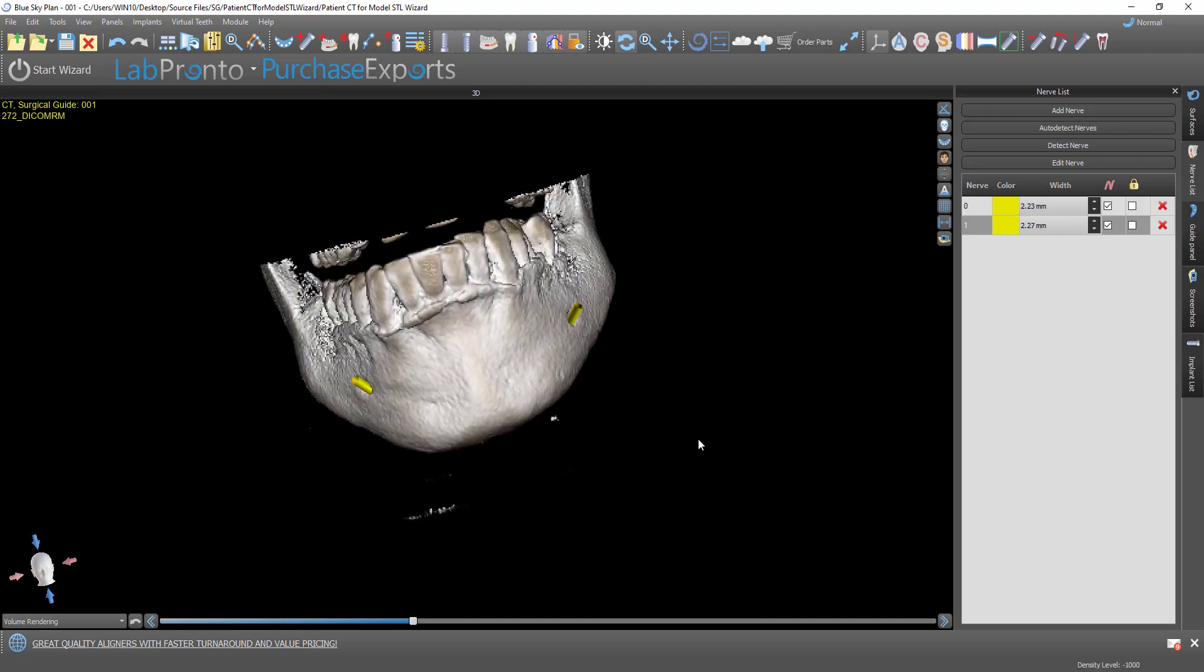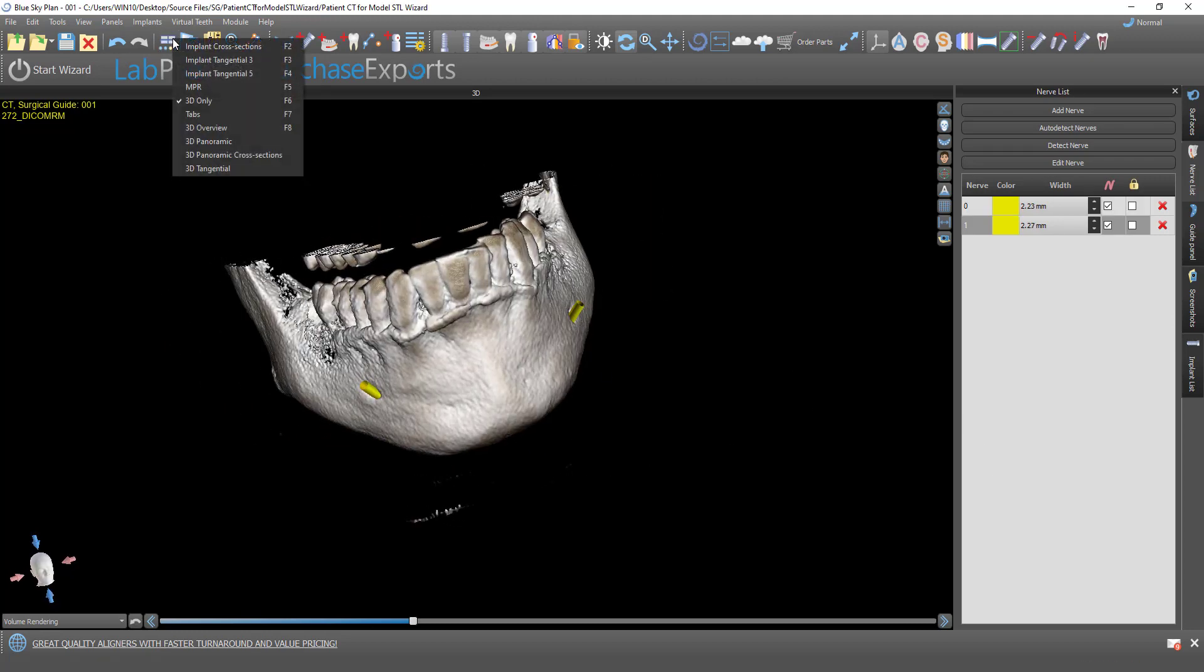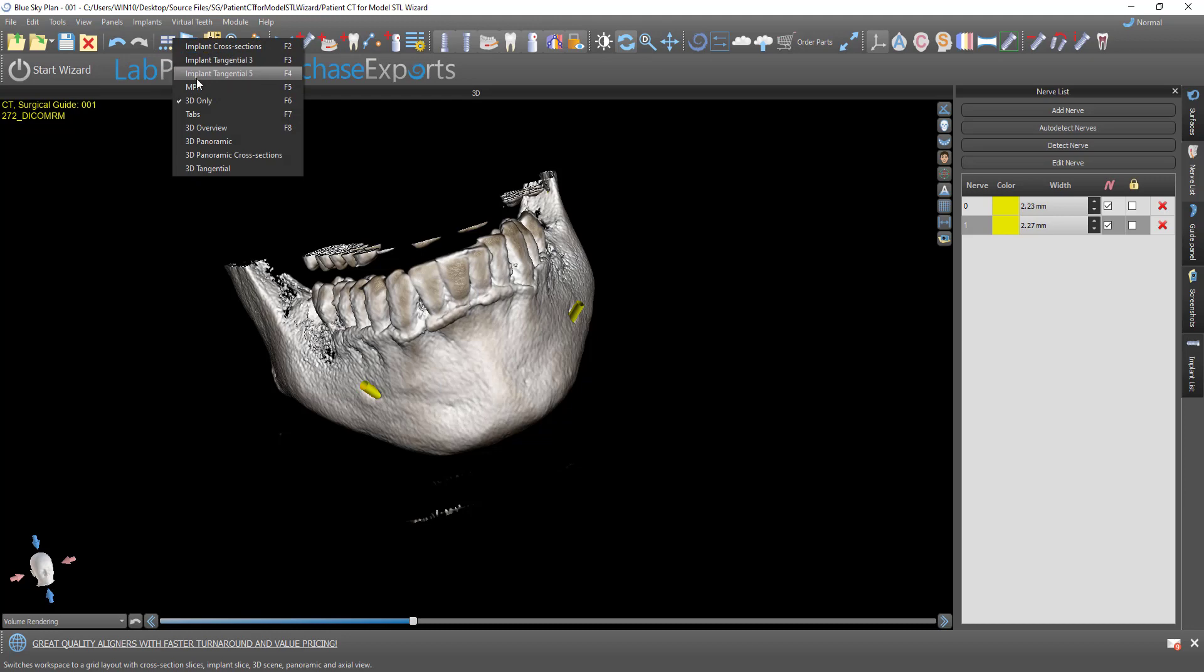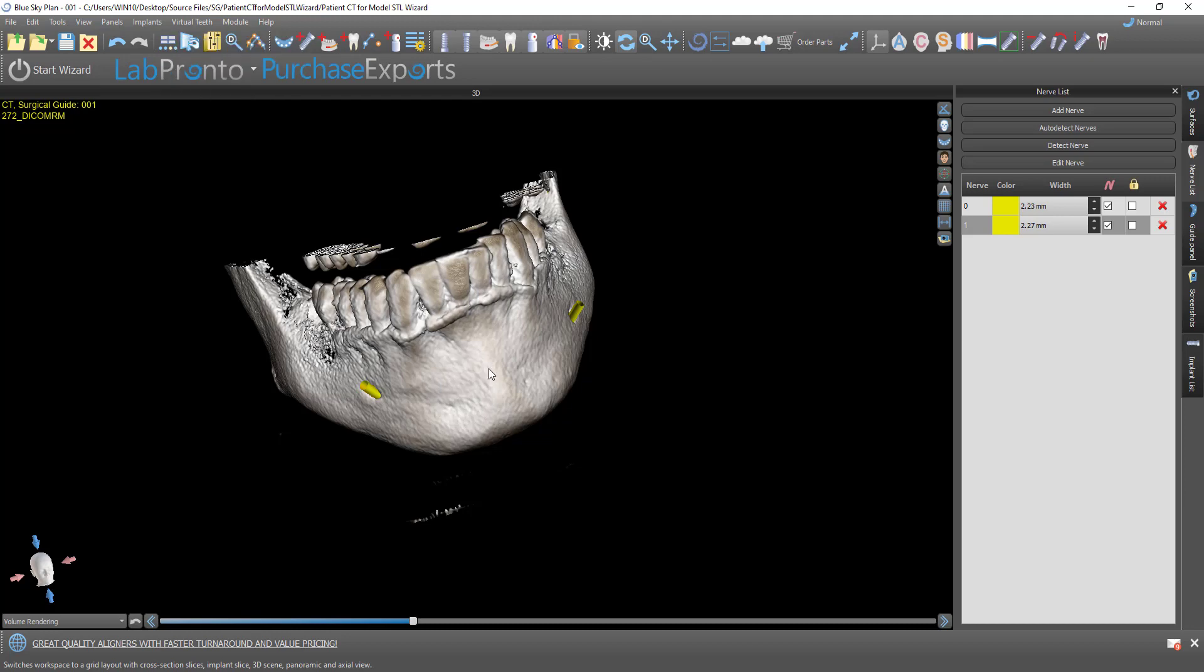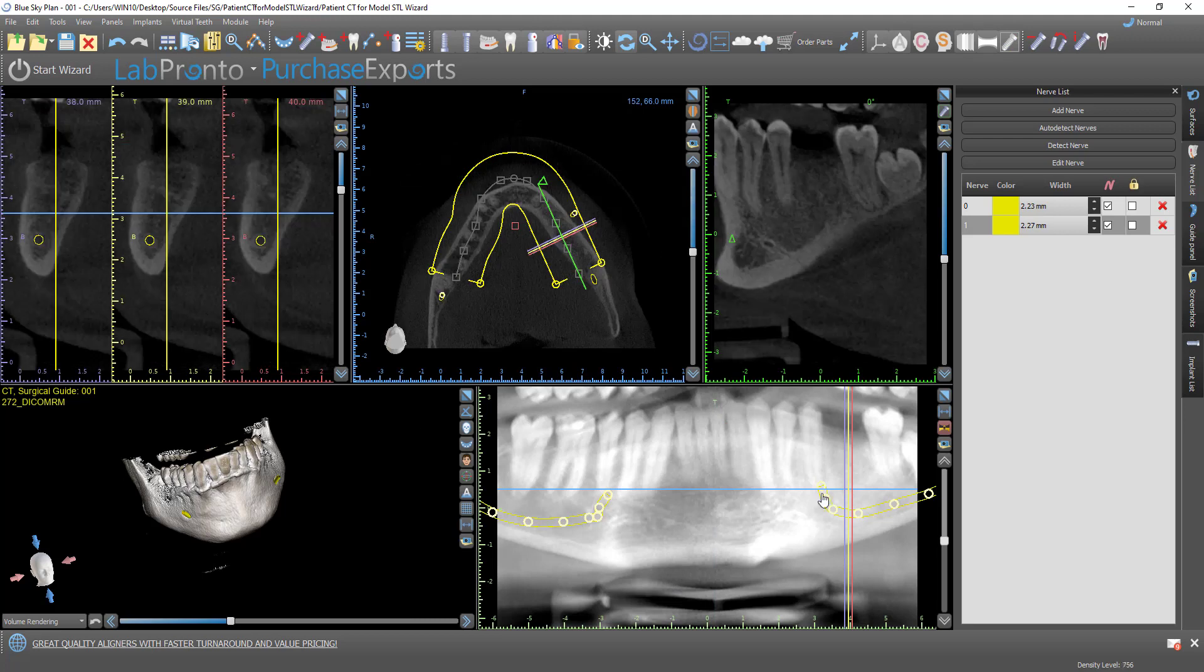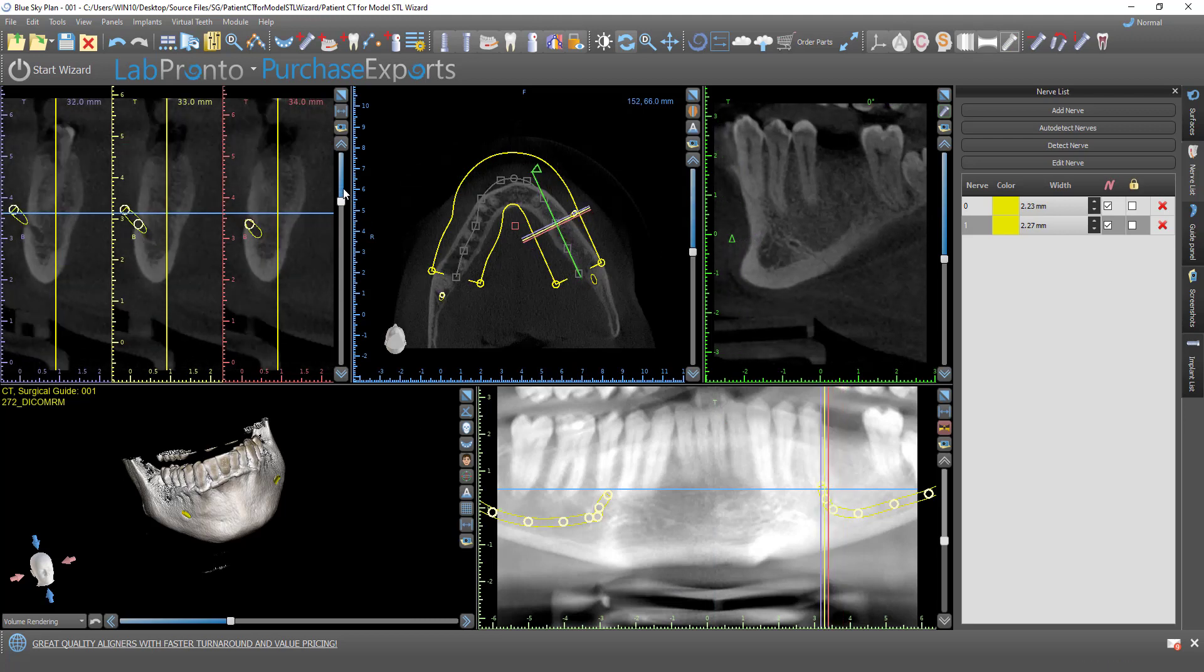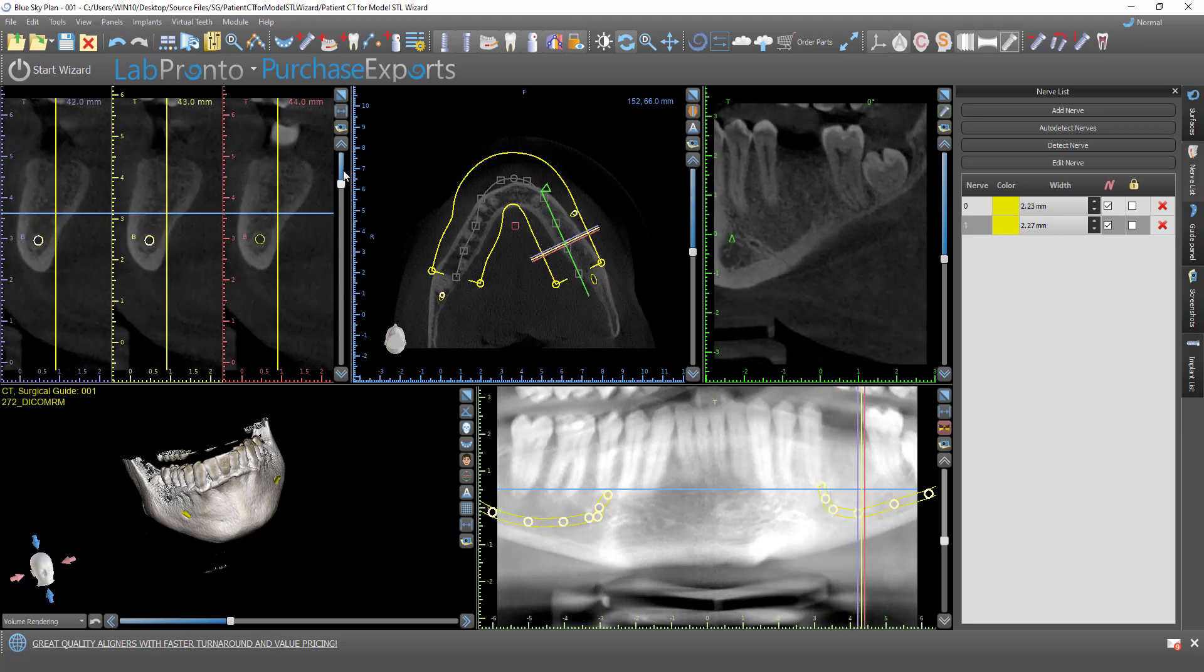And once again, we could see that. We could click F3 or go ahead and select Implant Tangential View. And we could review the nerve placement, if desired, in any of our views.